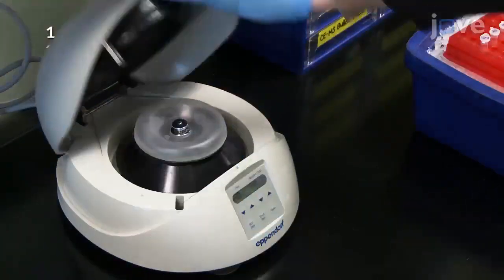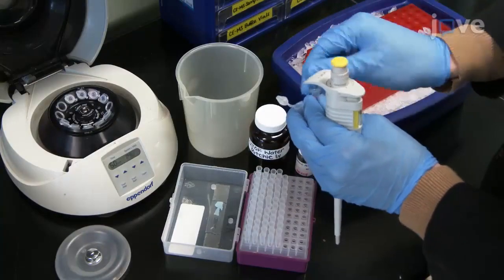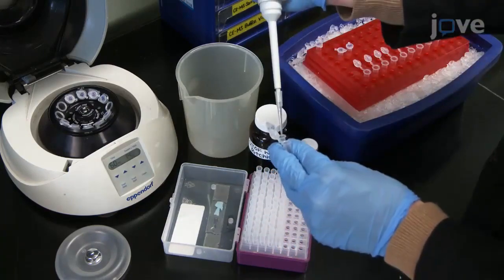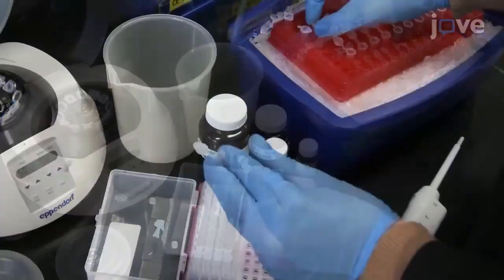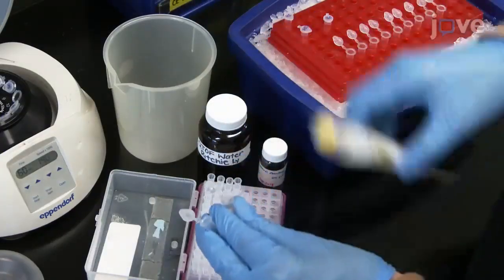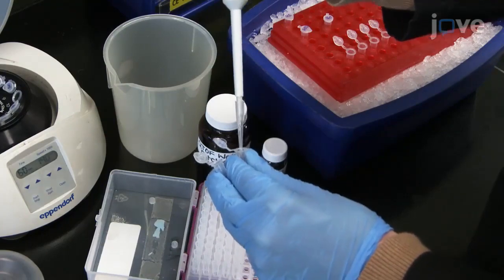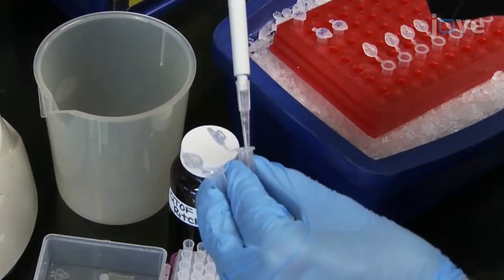Next, sediment the samples by centrifugation and combine 3 10 microliter aliquots of each sample with 10 microliters of deuterated internal standards, 5 microliters of a 4-fluoro-L-phenylalanine and 3-chloro-L-tyrosine solution, and 25 microliters of deionized water.